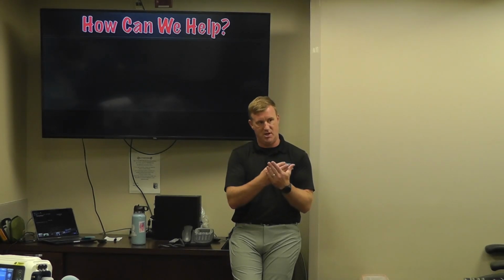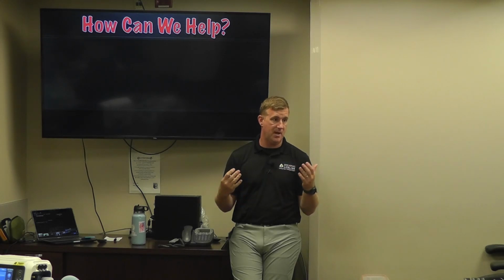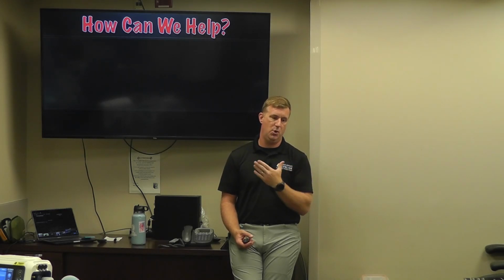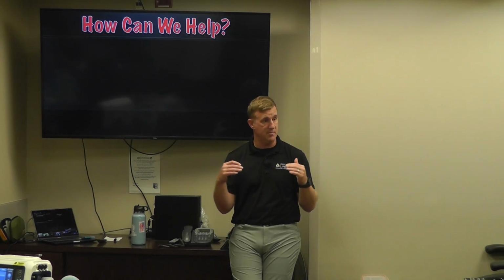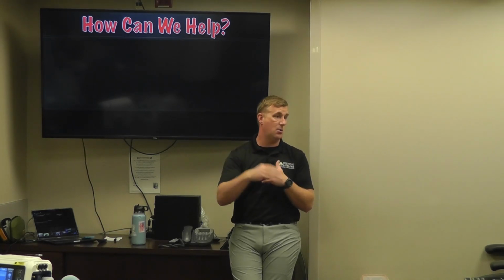So it's a continuous pressure, right? Bunches of people wear CPAP at night for obstructive sleep apnea, and all it does is create pressure and hold that pressure. So whether the patient's inhaling or exhaling, they're getting a push of pressure on their airway and alveoli, right? And that's going to help push gas across the alveolar membrane. Okay? The other name for CPAP is just PEEP. You'll see it labeled on these ventilators as PEEP. It's the same pressure, the pressure that we keep constant over the entire course of the breath.